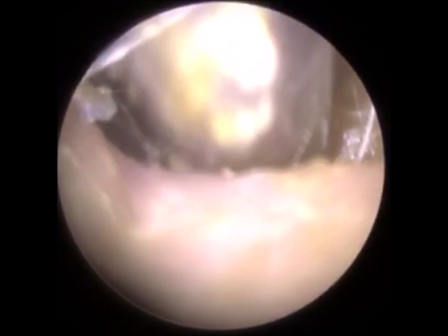So the most common is the suction probe, which is what I'm using at the moment, and this is the Zollner suction probe. We do have a fine end attachment that we can add to the top. The fine end is less suction power, but it's less noisy, and less traumatic for the patient if we come in contact with the canal wall or eardrum. We generally use the fine end for deeper wax and wax that's impacted on the eardrum.